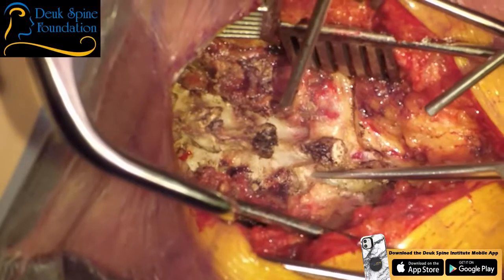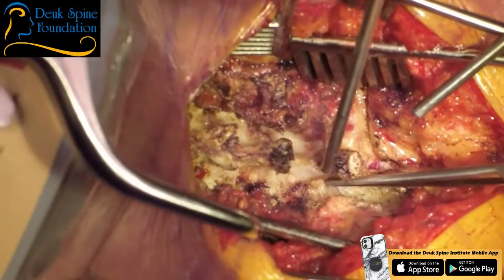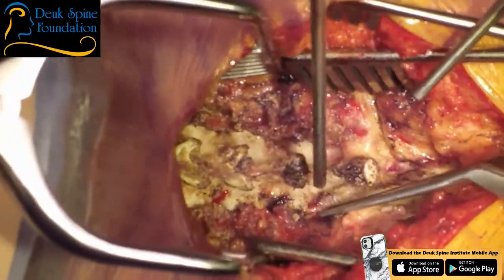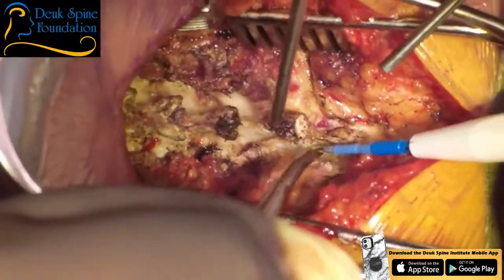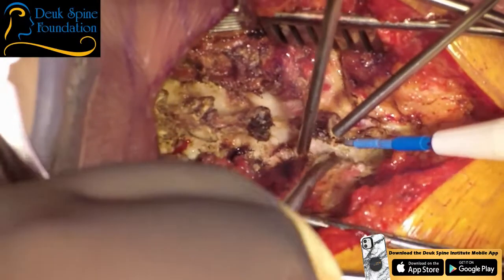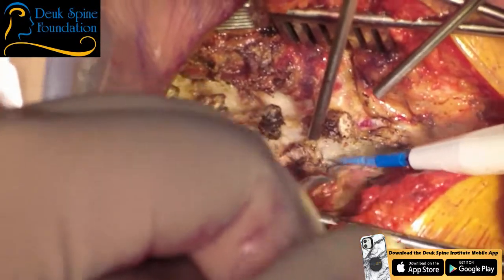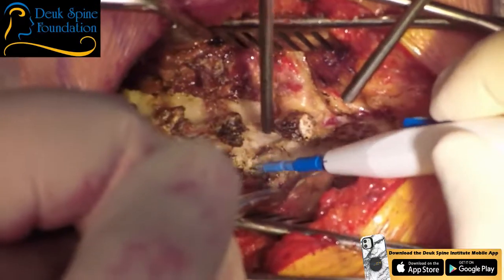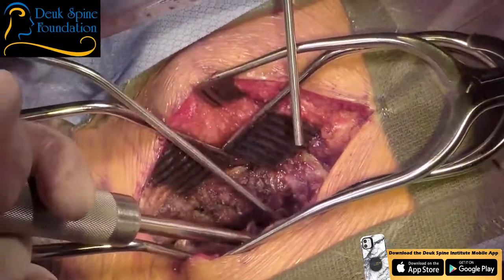And deep wounds really just tax the limits of the surgeon's ability, not just physically and visually, but also our instruments are all made for, you know, an average sized person basically. Now there are some instruments you can get that allow you to go deeper for deeper patients, but for the most part, your instruments are going to be part of your limitation, being able to get down all the way. But so far, everything's going well.